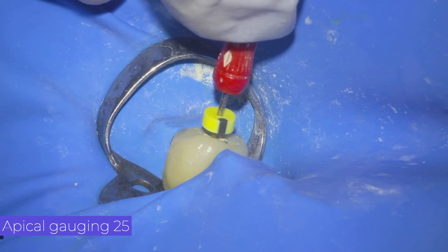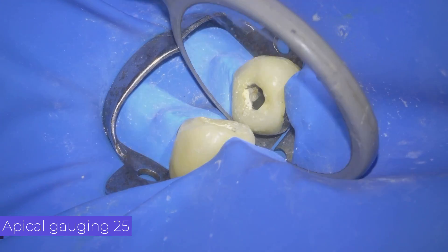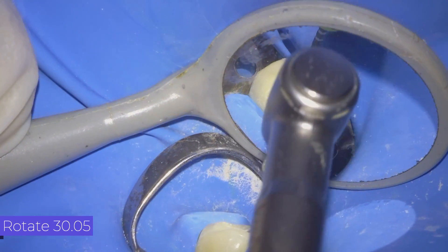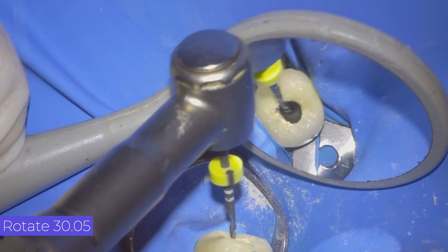We carry out this phase with 2% manual files. We calibrate tactilely — we lightly bind the 25 file apically and see that it does not remain trapped but rather goes down freely. Based on this, we decide to use a 30 file as the master apical file.